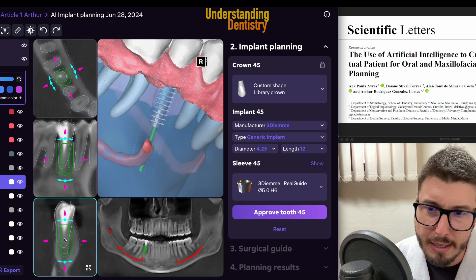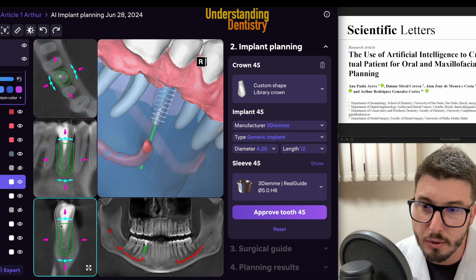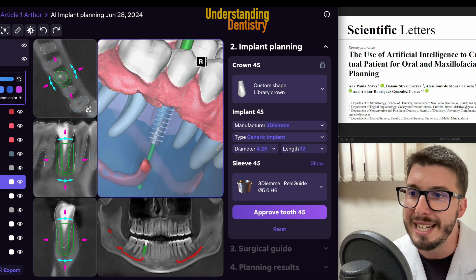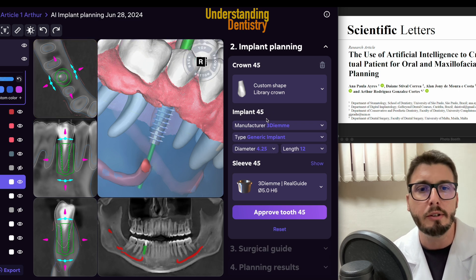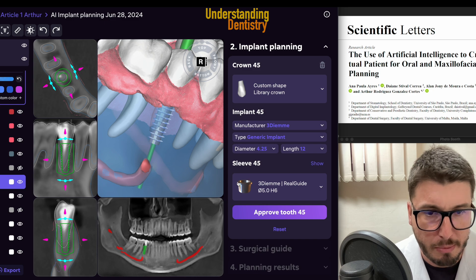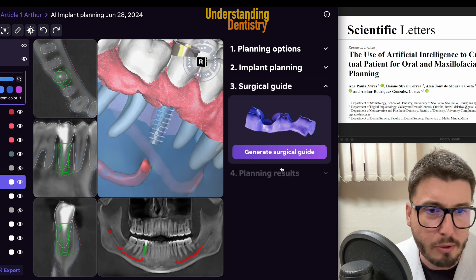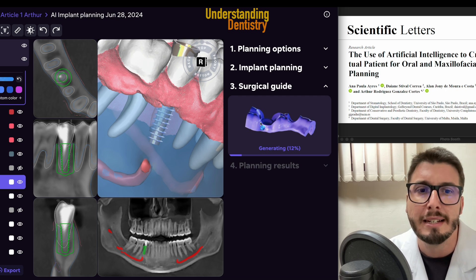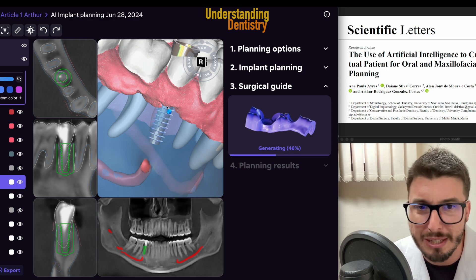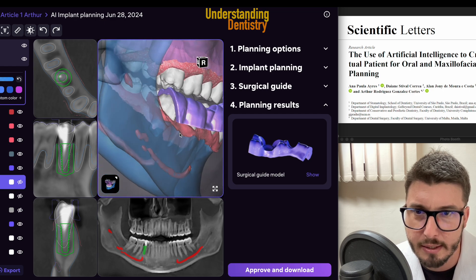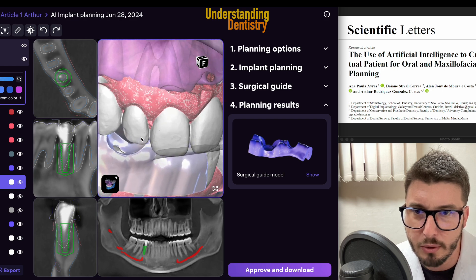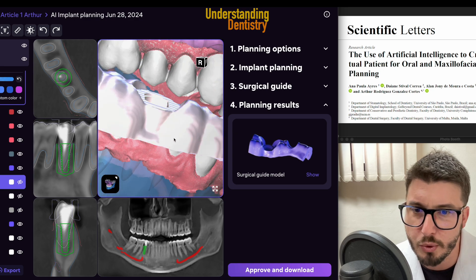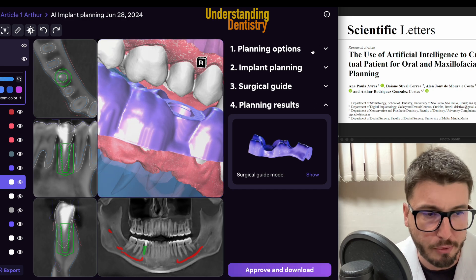You select based on implant theories — your emergence profile, tooth dimensions, and bone availability. That's why you have 2D and 3D views at the same time — amazing interface. You select your library, diameter, length, and sleeve. When you approve this, you go for the surgical guide. Basically you will have a surgical guide generated just like that. The surgical guide is an STL file which can be 3D printed. You can edit those results and then approve and download the surgical guide model.